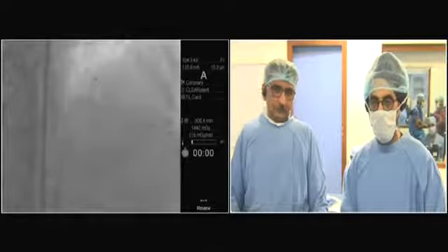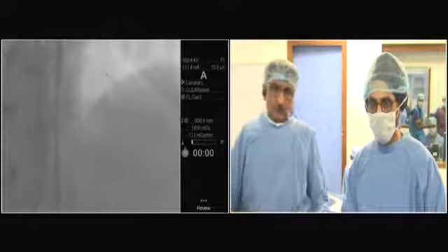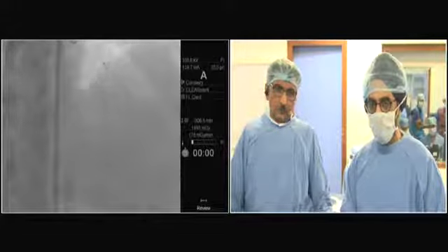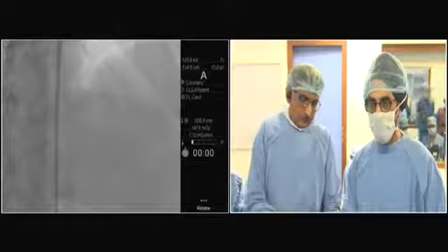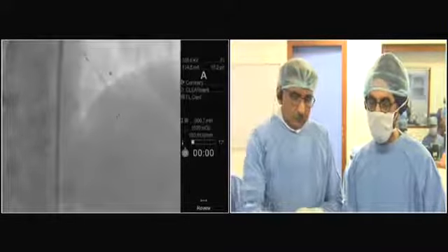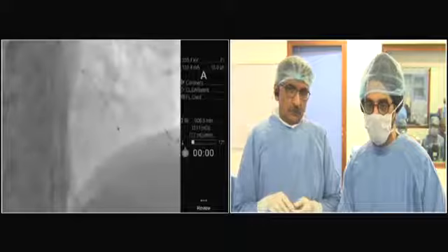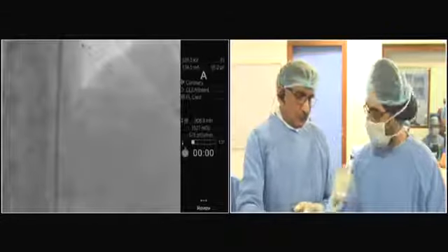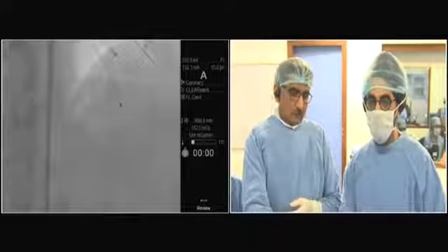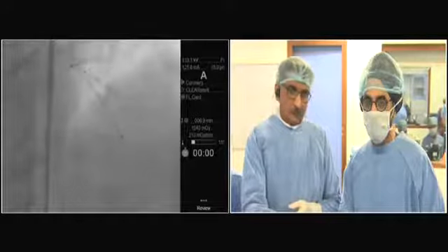Right. So if you see the angiogram very carefully, just after the aneurysm, the size of the vessel is about 4 and looks quite normal on the IVUS. So I'm going to place the stent very carefully just to allow me a POT with a 6 millimeter balloon. So I will use a 4 into 6 millimeter balloon to do a POT at that point. There may be a strut hanging in that dilated portion. I'm not going to really look at it, but I'm going to try to be as optimal as possible. If I can do a POT with a 4 into 6 millimeter balloon, I would be happy doing that.